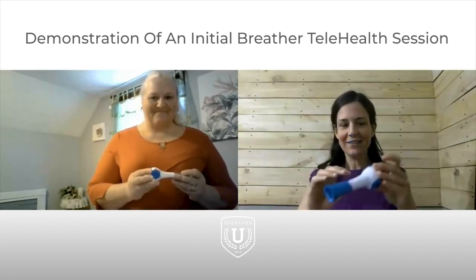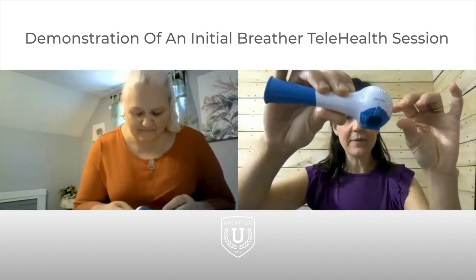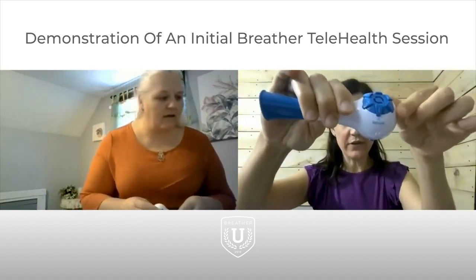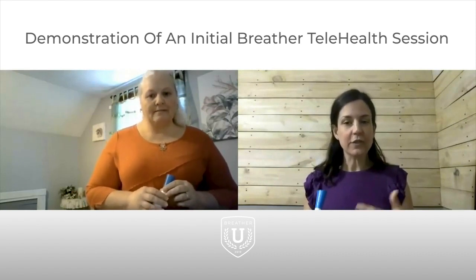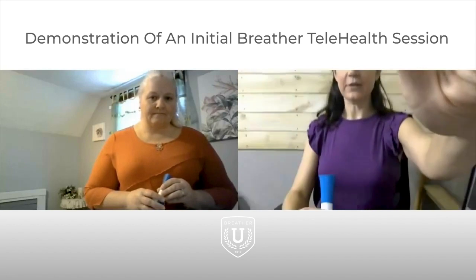I've got mine. You'll see that there are some dials. To begin with, I want each to be set at 1. So if it's set any other number, go ahead and switch it back to 1 for inhale and 1 for exhale. Okay? All right, I'm on 1. All right, I'm going to do it first just so you can see what I'm doing and you can hear the way it sounds. I'm going to move my camera a little bit so you can see me.